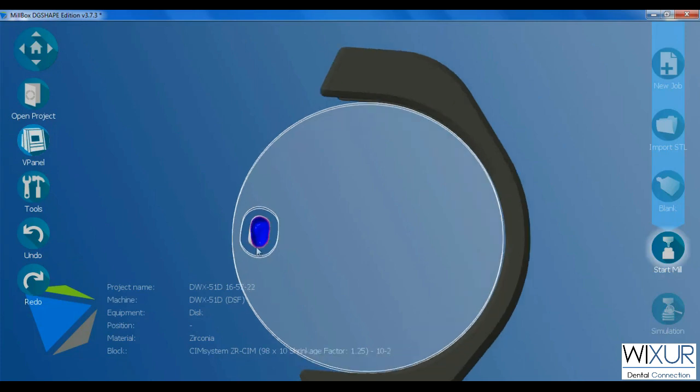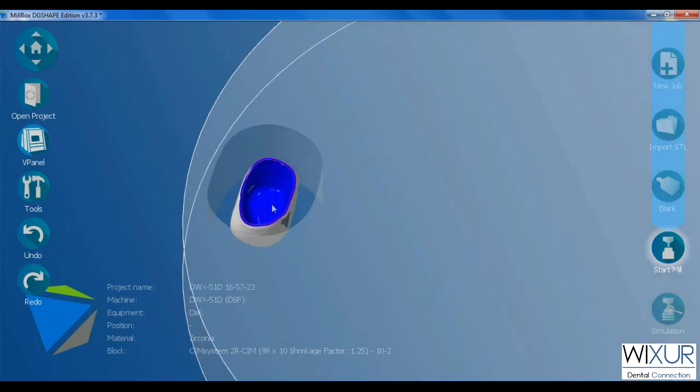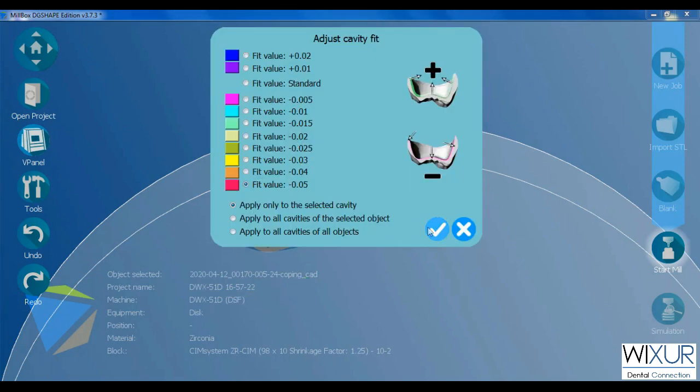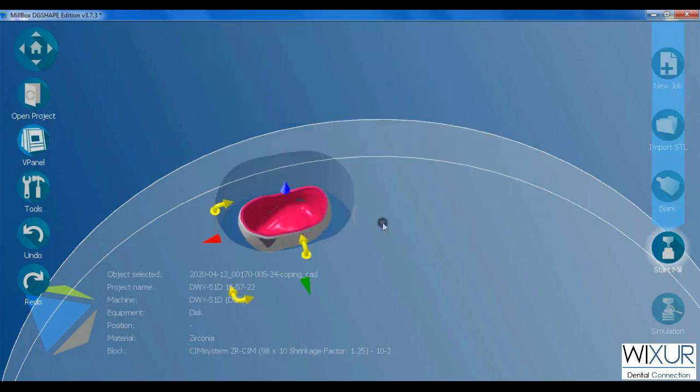The color inside the crown shows the cavity fit that is chosen — blue for a positive number and red for a negative number.